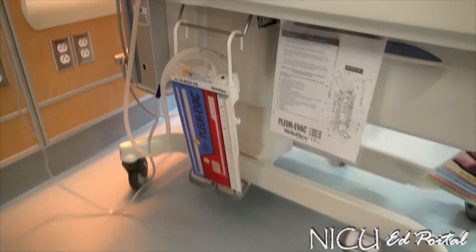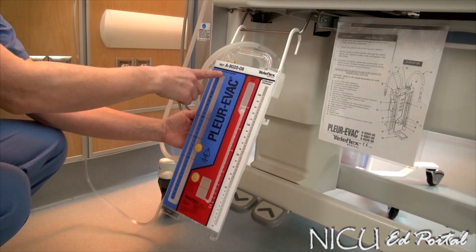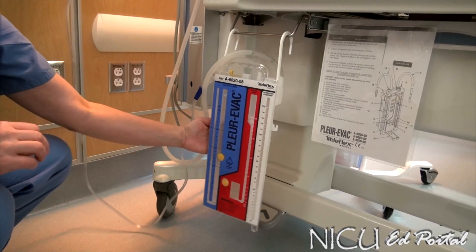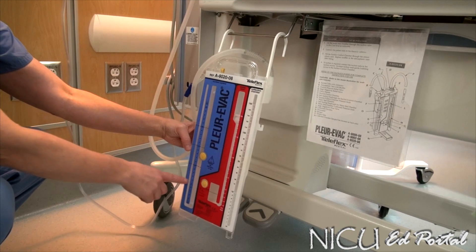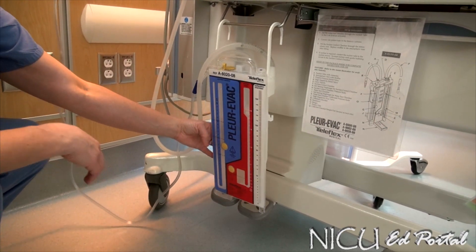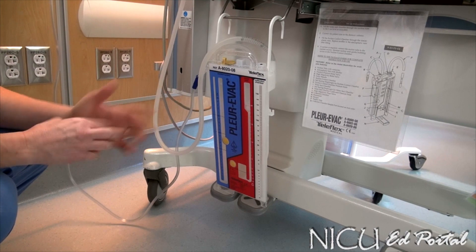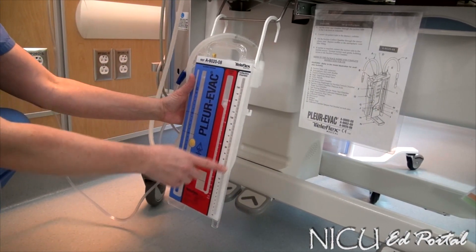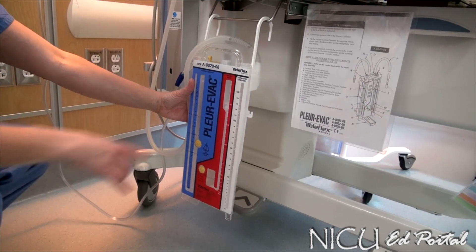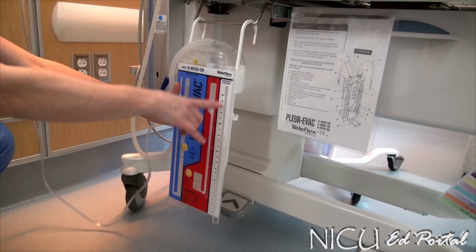This here is your drainage system, the Plurvatch Infant Unit. This system has three chambers that you need to be familiar with. It has a suction control chamber, which is basically what the provider orders in centimeters of water suction. Your water seal chamber is the second chamber that we will fill to the marked line. And then the collection chamber is your last chamber, where you would have fluid drainage — you need to keep track of the amount and color. In our unit, we don't see a lot of drainage unless you're dealing with a baby with a chylothorax or post-op.